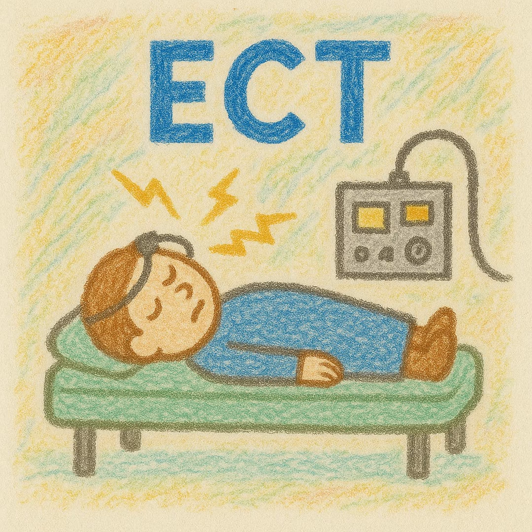If your seizure threshold is 100 millicoulombs, well, that's actually a pretty high seizure threshold, and most devices aren't going to go above, say, 576 millicoulombs for the device that I use. So you're basically going to be maxing it out at that point. But that was just to make the math easier. Most people are going to have a seizure threshold much lower than that. And so you're going to be treating, again, 6 to 10 times, usually trying to stay on the lower side.